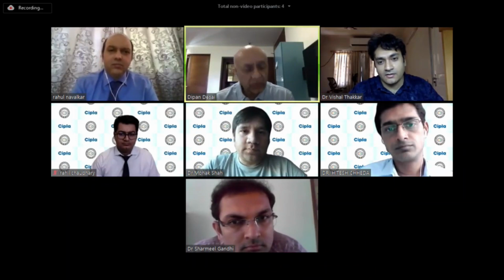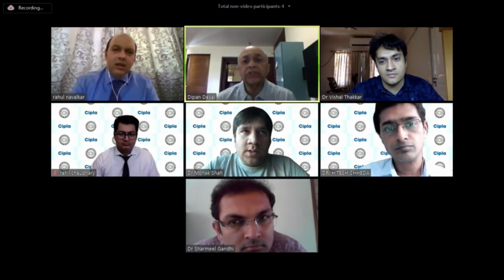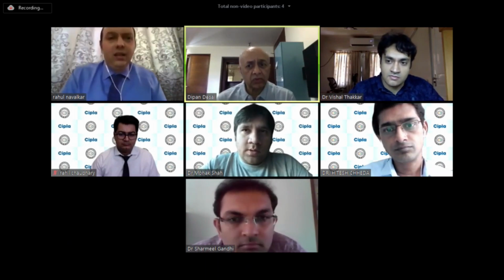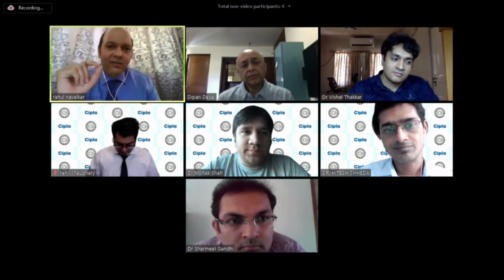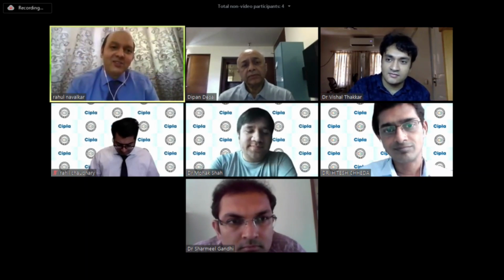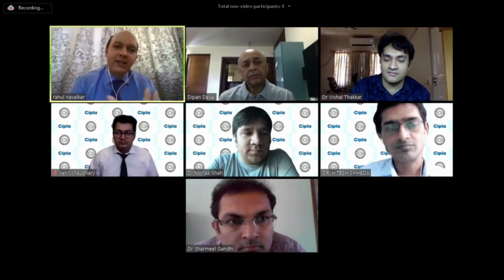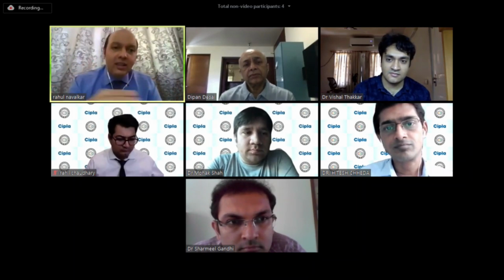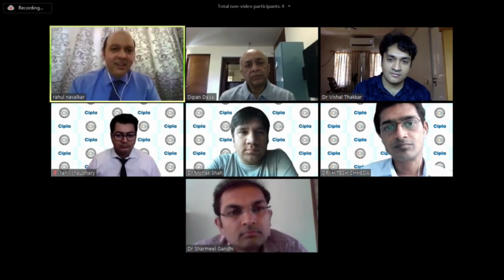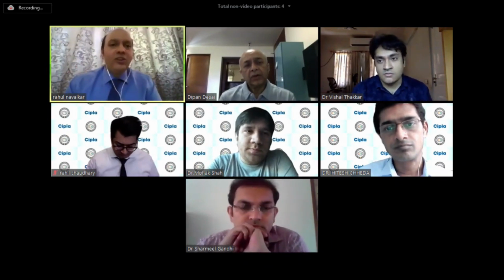So I would like to ask a question, and I agree with you, Dr. Mohak. Would you do a toric IOL in these patients? Because they have some form of irregular astigmatism and unstable refractions. So, the panel, anybody can answer. Actually, one of the persons who really goes ahead with toric lenses in this is Dr. Arun Gulani. But he does not only go ahead with a lens, he looks at it in its entirety. If he feels there's a minor scar which is causing the irregular astigmatism, he wants to open up the cornea, take out the scar with his corneoplastic technique, and then move ahead with implanting. After that, calculate. So maybe do a 2 or 3 step procedure, not do only cataract surgery and put a toric IOL.